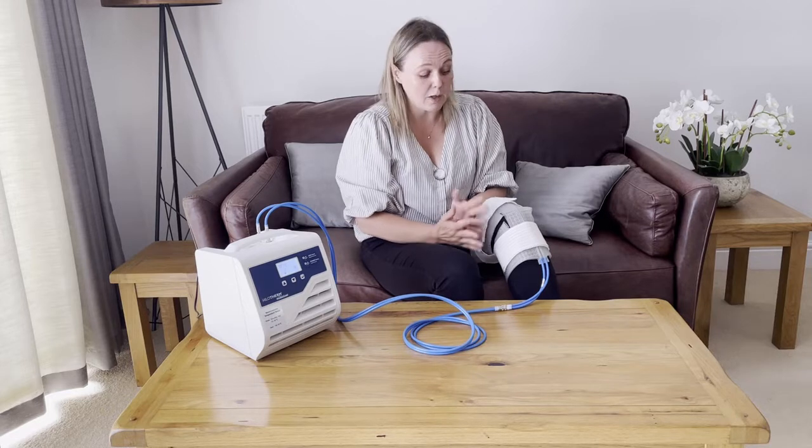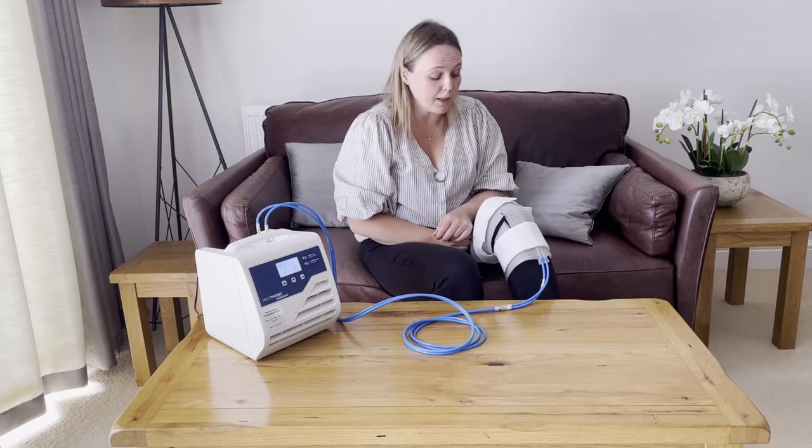Hopefully that shows you how to fit the knee cuff safely. Please do refer to our troubleshooting video if you have any queries. Thank you.